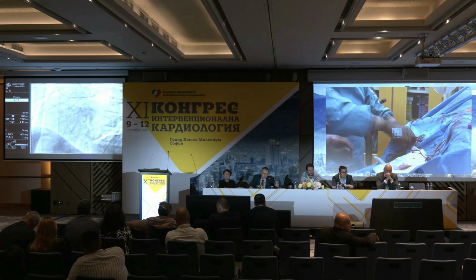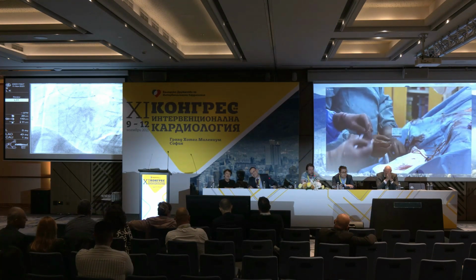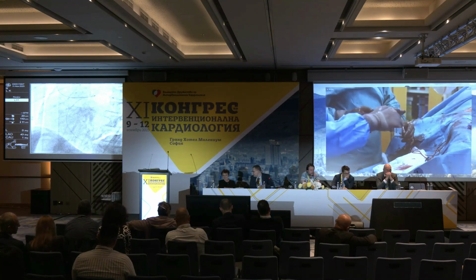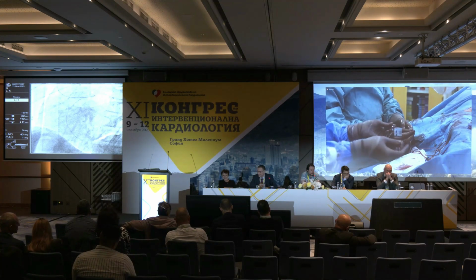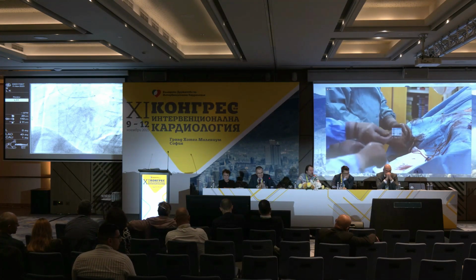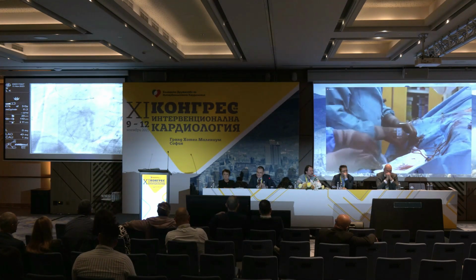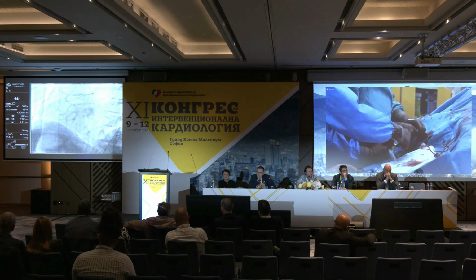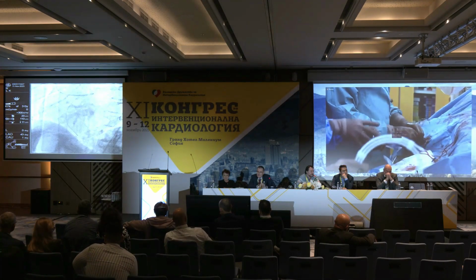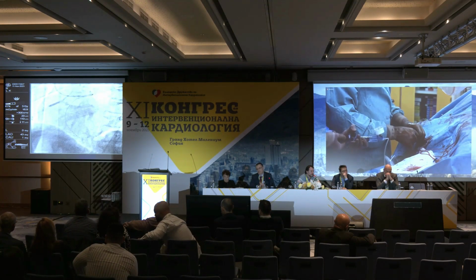And now post-dilatation IVUS. Educational IVUS. Okay. Yeah, we have opened it already. So we will see whether we were accurate enough to do that. And then you will show us how you retrieve your microcatheter and your wires free. Yes. So let's inflate there, 10, 12. This is the proximal cap, 4.5, 14, down.